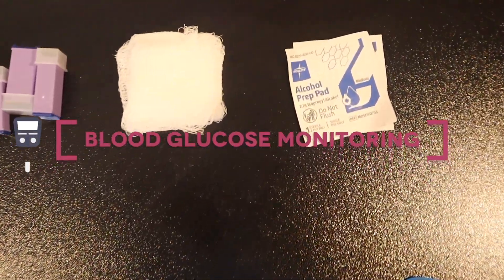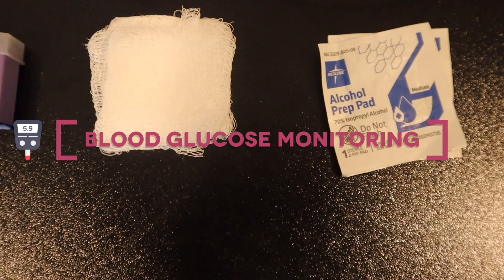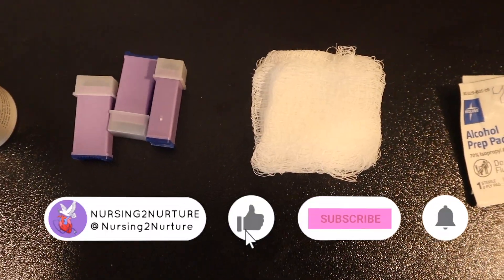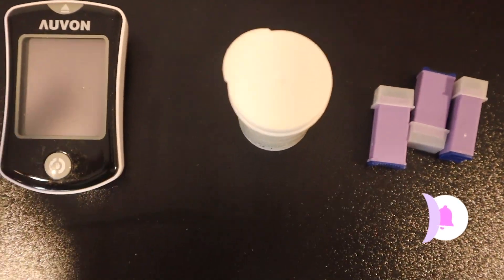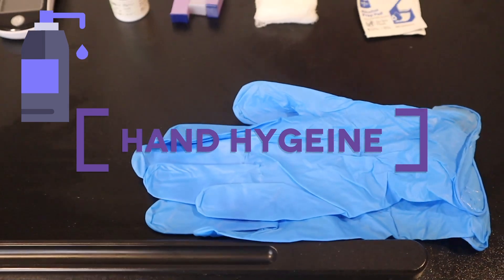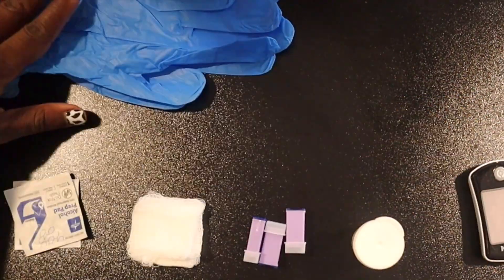Hey everyone, today we're going to go over how to complete a blood glucose test using a finger prick. Before we begin this process, please be sure to perform hand hygiene and gather all of your supplies.